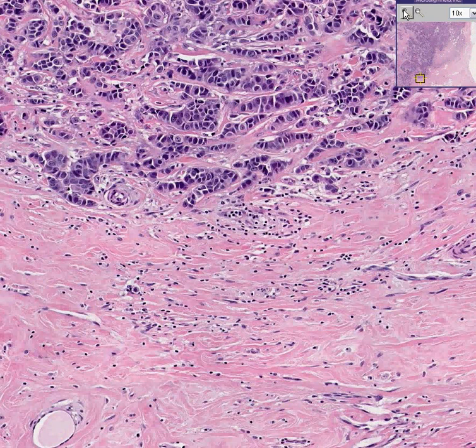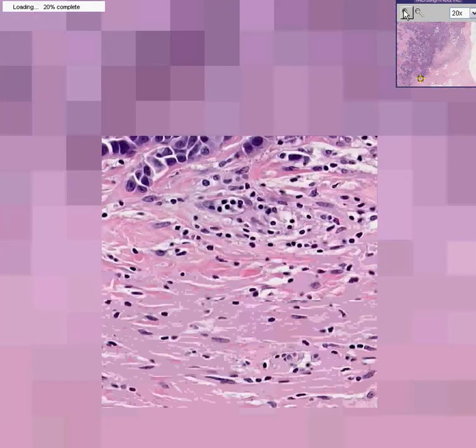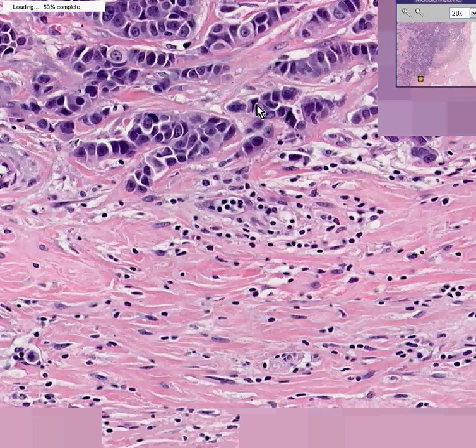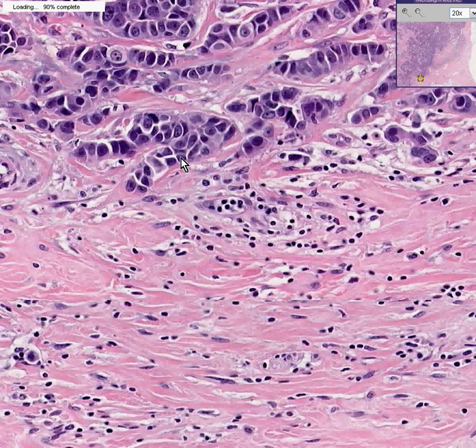And in addition, if you would like to go up to high power to the nuclei, which all the neophytes do, you could see that these infiltrating cells are not uniform. Some are much, much darker than their neighbors, and some are much, much bigger than their neighbors. These are the general concepts of hyperchromasia and pleomorphism, respectively, which you see with most cancers, including many or most of the breast cancers.